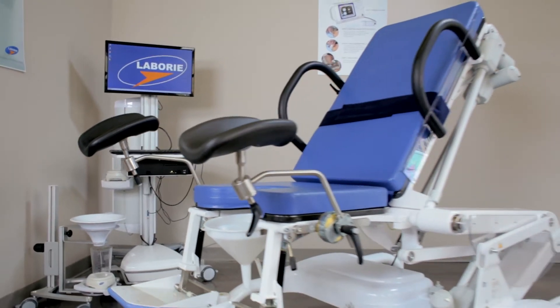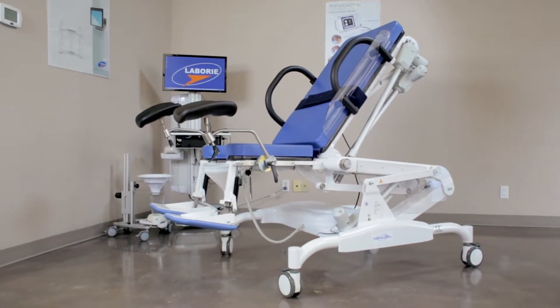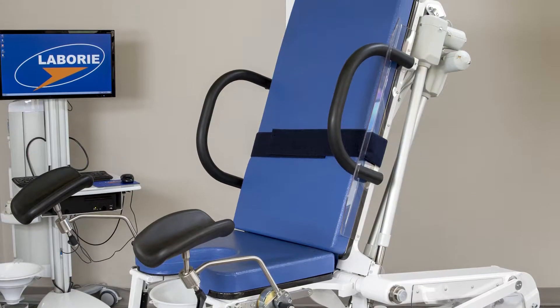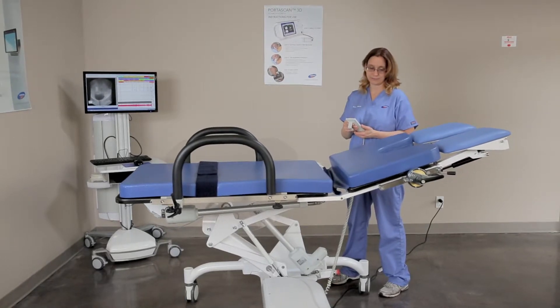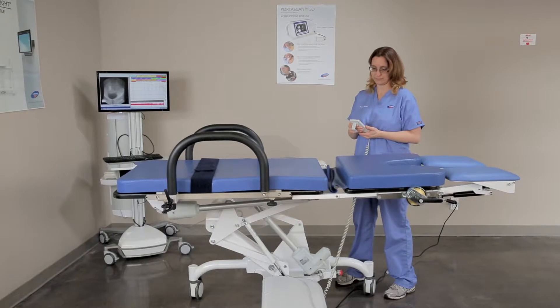The 6210 video fluoroscopy table is a versatile urology procedure table designed to support the patient in any position during video fluoroscopy urodynamic exams. This procedure table's three motors can be easily controlled through a handheld remote for unparalleled patient positioning.